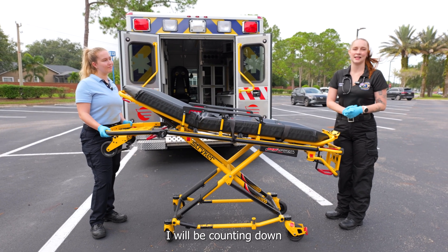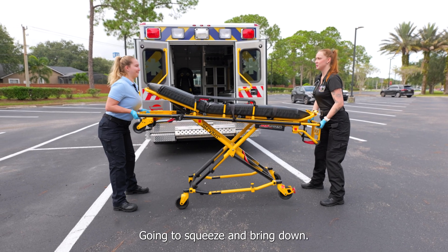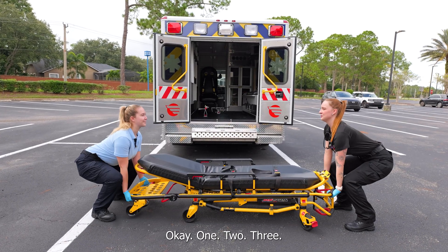For this exercise I will be counting down and we will move on three. One, two, three. Going to squeeze and bring down. We're going to bring our patient up on three. One, two, three.